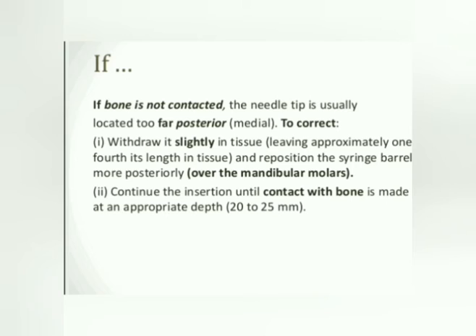If the bone is not contacted, needle tip is usually located too far posteriorly. To correct it, withdraw it slightly in tissue and reposition the syringe barrel more posteriorly. Continue the insertion until the contact with bone is made at appropriate depth.